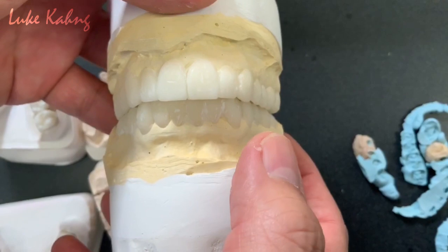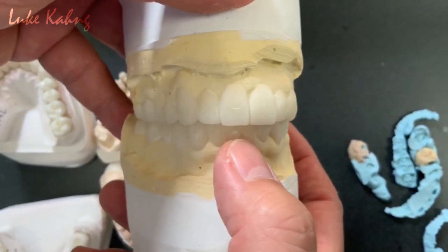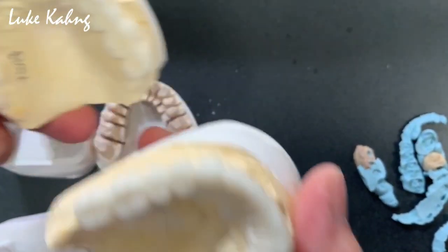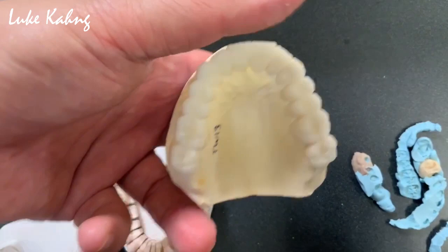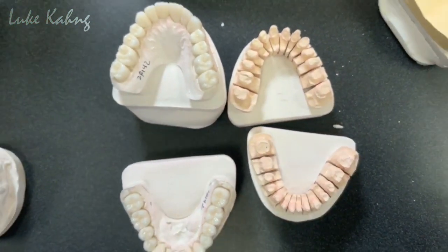Sorry, this is we scan it, so it's a little bit dusty down there. We scan it, so we wax up. We send it to the doctor, a nice wax up. We just finish with better occlusion morphology, and then doctors prep this. Okay, and then we mount it.